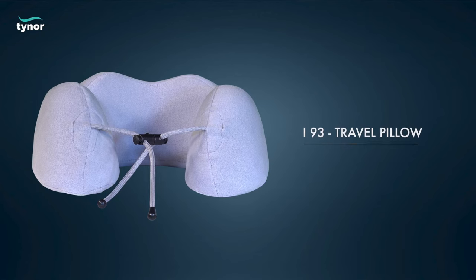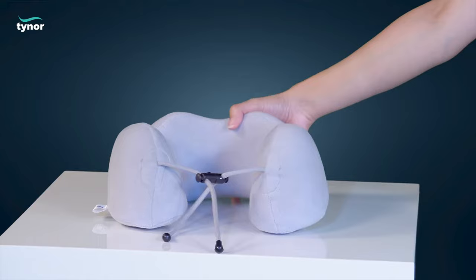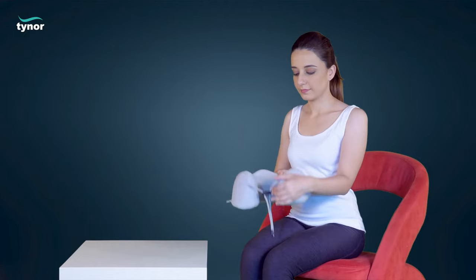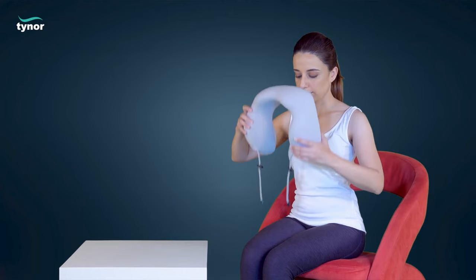Here we will discuss how to use the travel pillow. The travel pillow comes in universal size. To unlock the closure assembly, press the closure button and wrap the travel pillow around the neck.